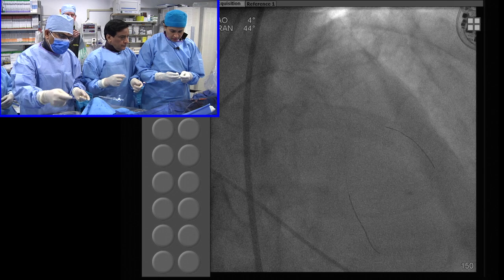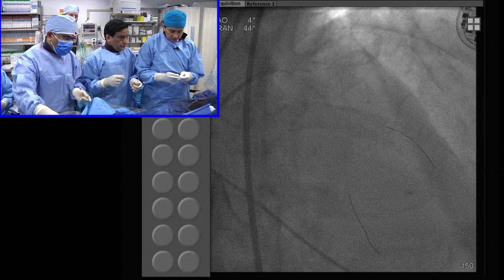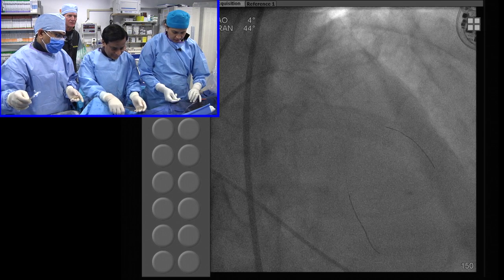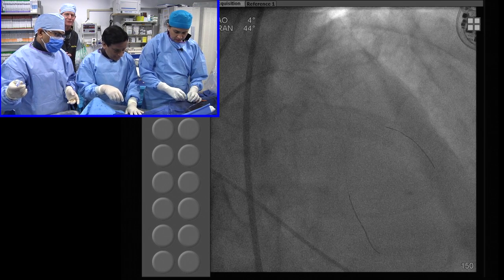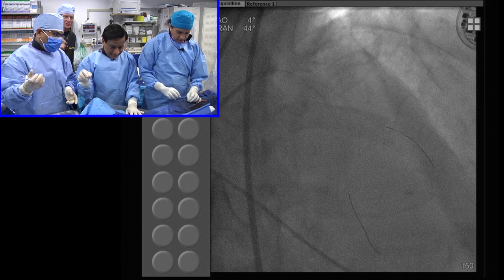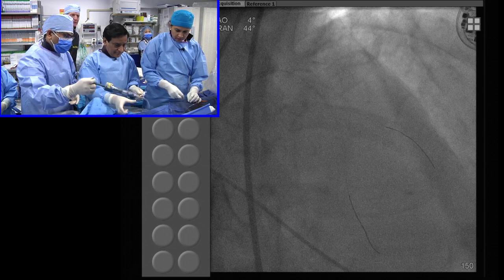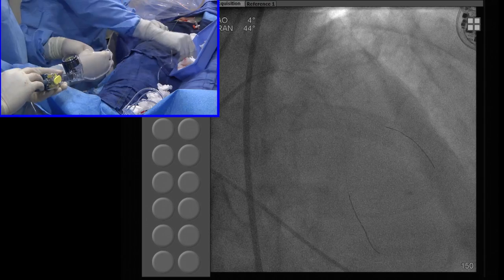And you can see here the guide catheter support is actually really important for the diagonal. Yes. You know, even just to get the metallic stent across. So this is fundamental angioplasty. Your life will be simpler, your procedures will go faster if you think about each of these things, whether you're doing metallic stenting or doing Absorb, of course.